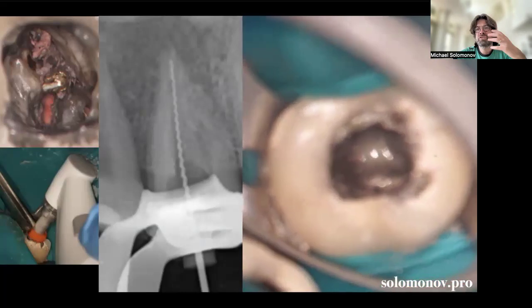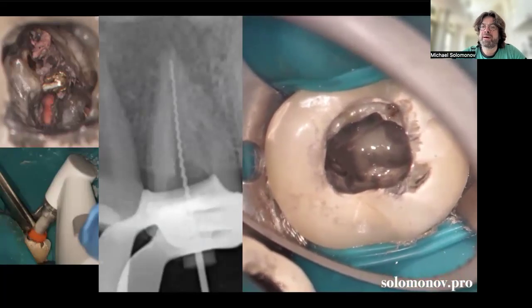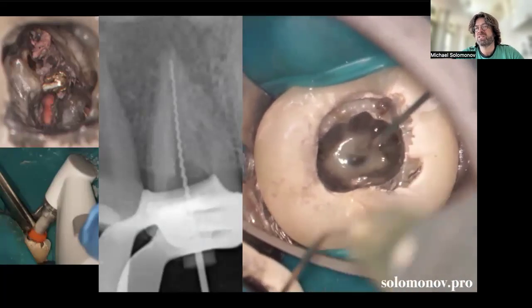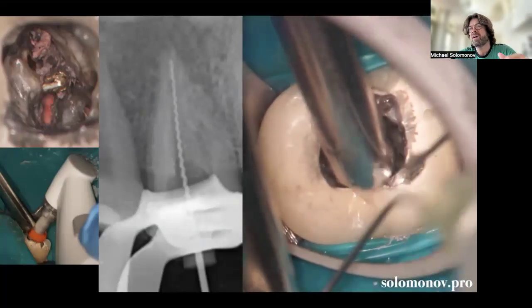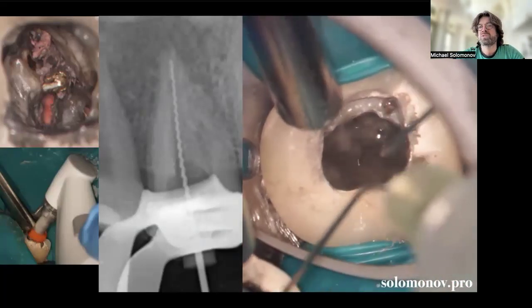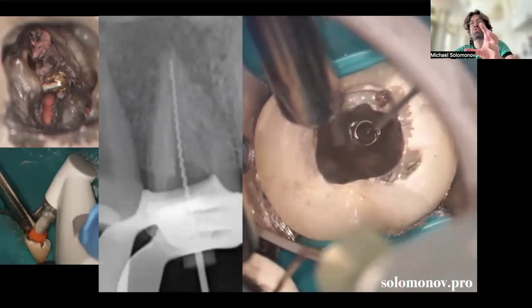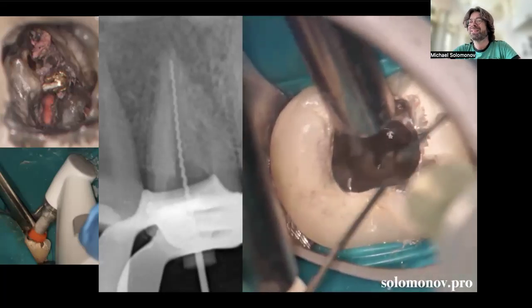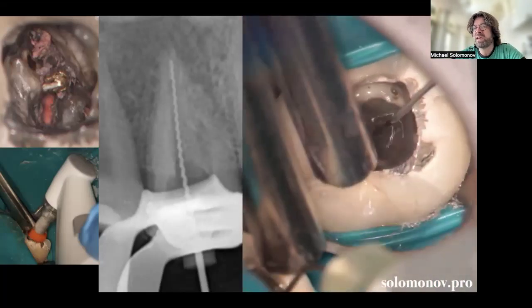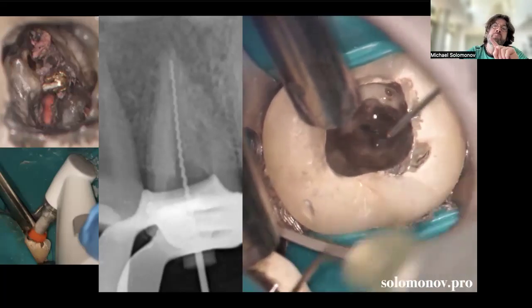also in this case, after the cleaning of the canal, we see the exudate, the pus exudate, and we understand the pus exudate is a sign of very active infection. It's millions of polymorphonuclear cells that die after oxidative burst. That's understandable for me in this specific case. Surely I will use calcium hydroxide, and mostly not because of antibacterial properties or dissolution properties, but because it's the only material that can really dissolve LPS, lipopolysaccharide, the most powerful antigen of gram-negative bacteria. And this is so important.